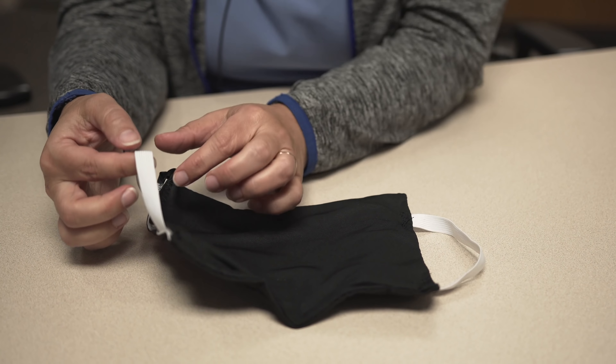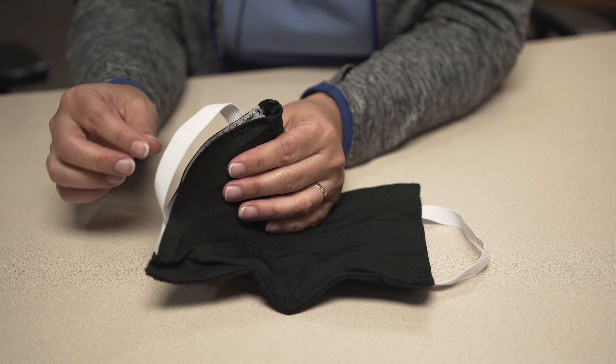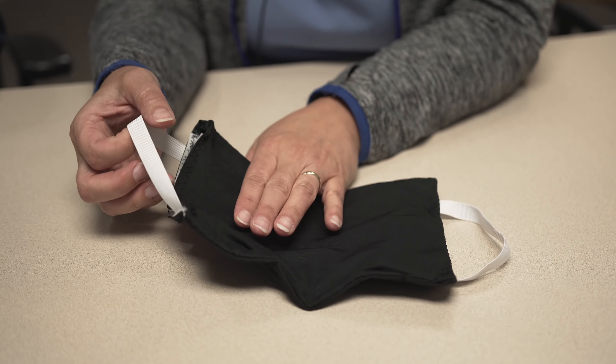So this does have some stamina to it. The elastic on the side is soft — we chose softer elastic to make it more comfortable for the nurses. The mask is currently one single color because it's a prototype, but it will be two colors so the staff can easily recognize the inside and the outside.